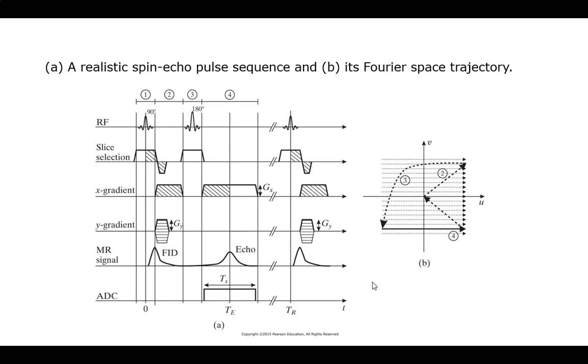Again, this one is lower and slower because we usually do some correction on the edge. This one, we try to do it fast and let it down. So the combination of this is moving X, moving Y. And in this case, X is always positive. That's why they don't show it bidirectional. Y could be either direction because I could go up or down.